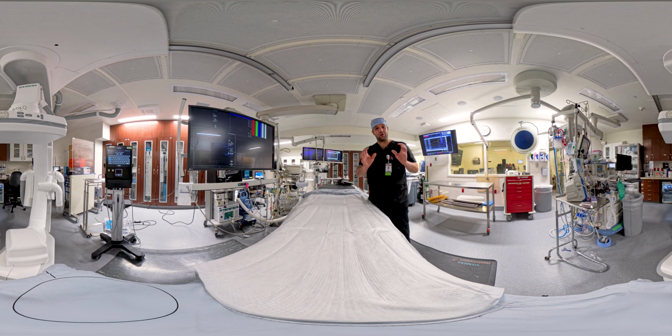Once the catheters are in your heart, then I'll be able to study and figure out where those extra beats or the arrhythmias are coming from. And once I am comfortable and sure of the locations, then I'll start ablating. Ablation is basically using heat energy to take care of those extra beats.